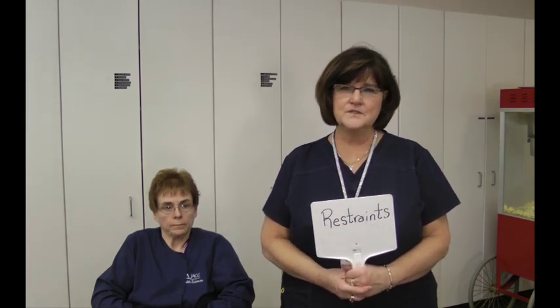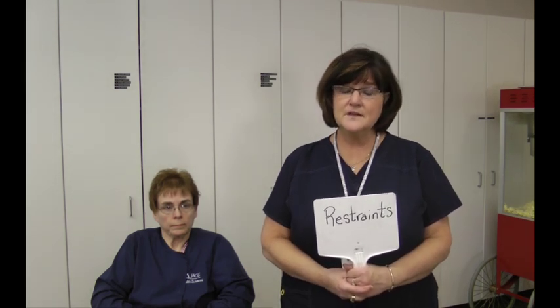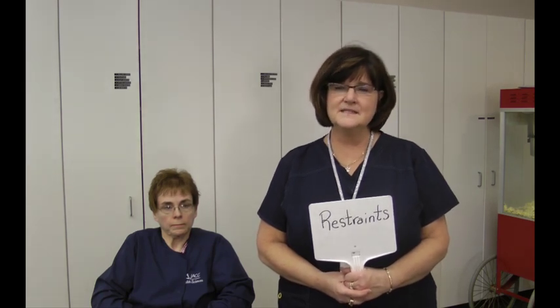We do not want anyone to get hurt with a restraint. And again, they're used very seldom in a nursing home. We're seeing them more in the hospitals at this time. So I'd like to demonstrate a couple of them for you.